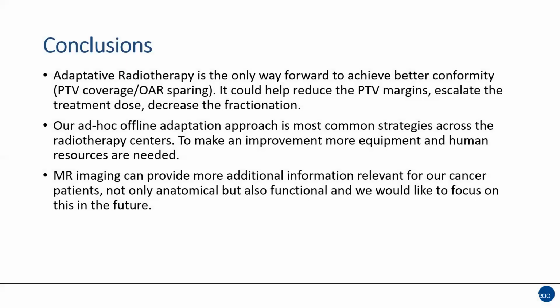So in the conclusions, of course, adaptive radiotherapy is the only way forward to achieve better conformity, coverage, and sparing of organs at risk. Of course, we all know this. It could help to do all these beautiful things that were mentioned before: reduce the margins, escalate the dose, and decrease the fractionation.